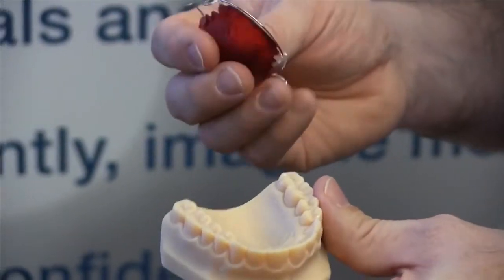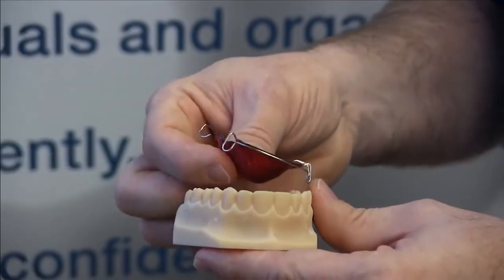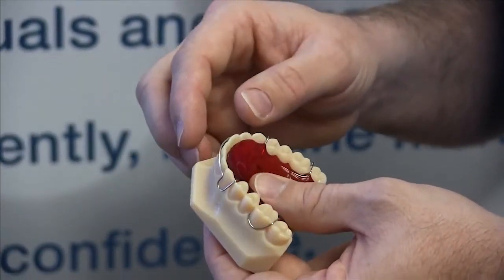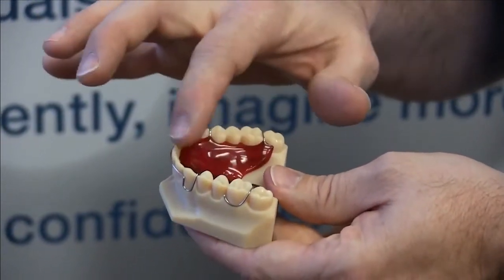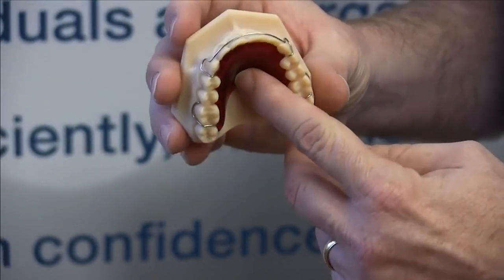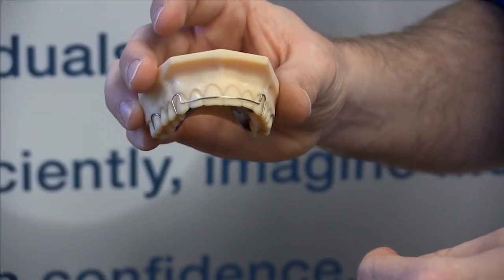We print the model out and send it over to the first department that actually bends the wire to fit in the correct places to retain the teeth. Then we pour and trim the acrylic to fit into the patient's mouth. And of course, when it's done, it holds everything in alignment.